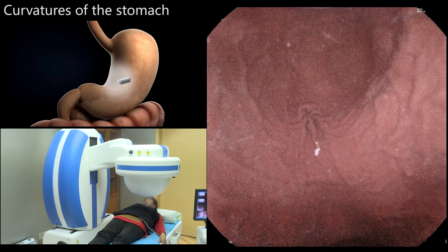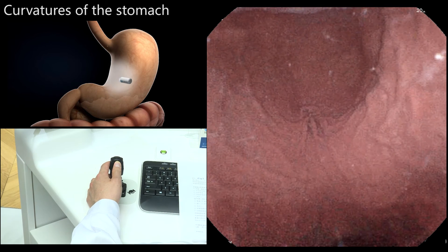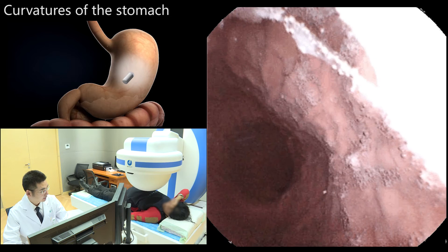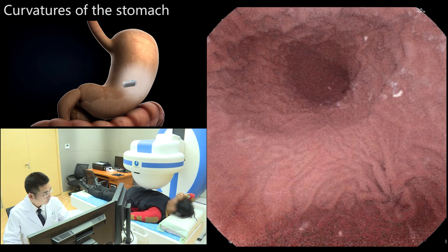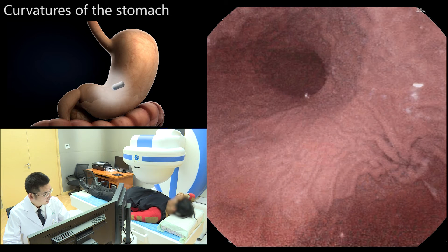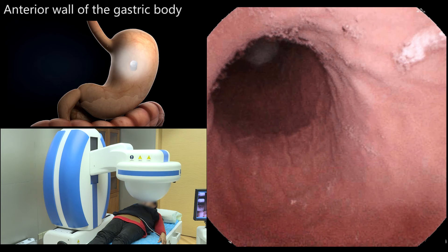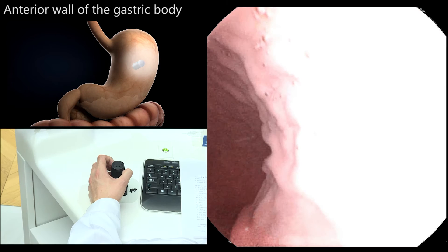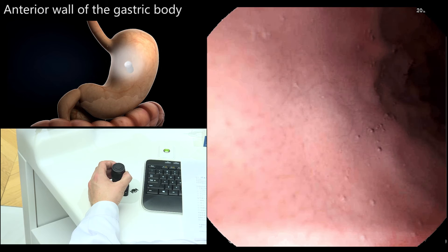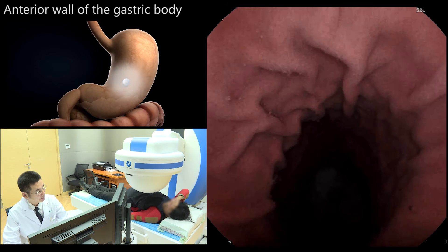With the patient in the supine position, the magnetic ball was moved to the middle left side of the abdomen and then lifted with the camera oriented upwards to observe the anterior wall of the gastric body.